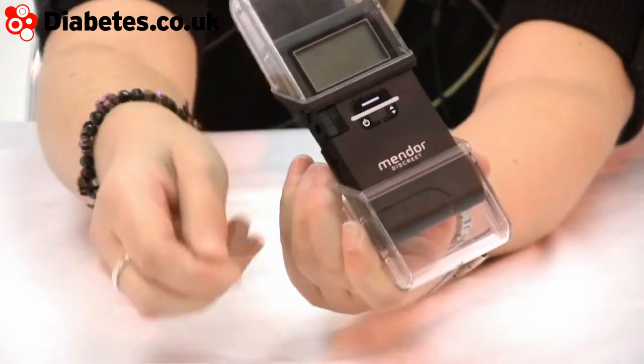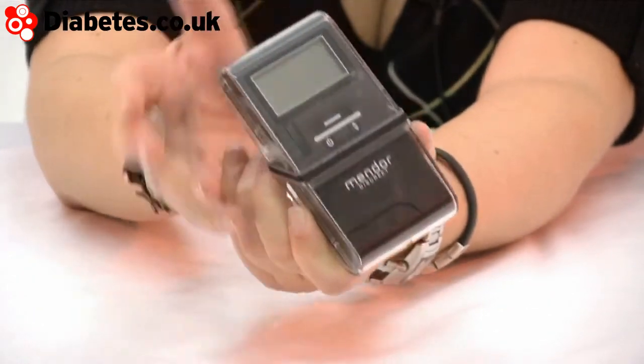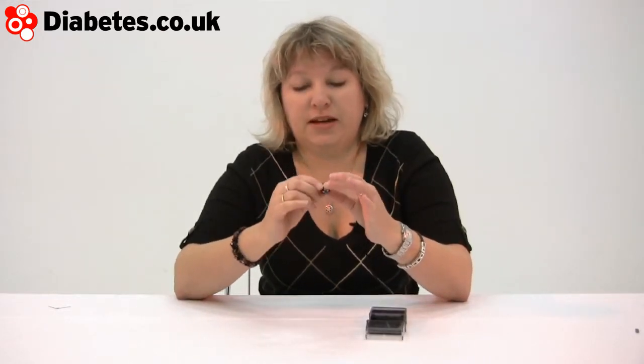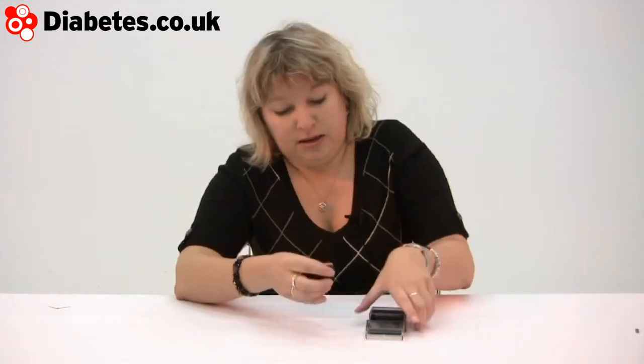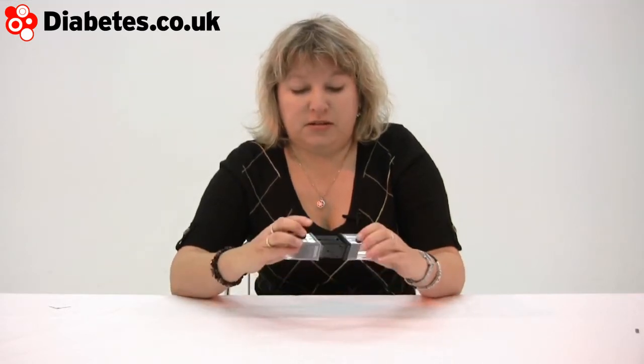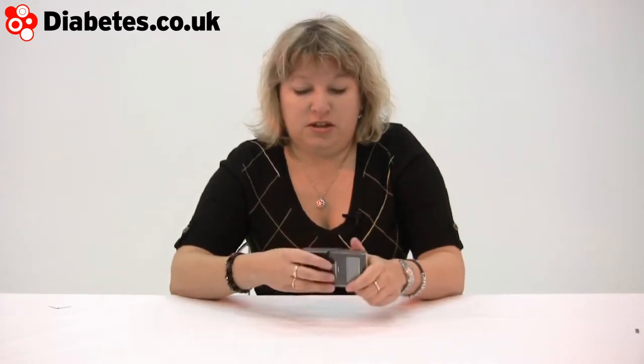And then you can just pull that out and close it all down again. This is the bit where the lancing device is, and to be honest, we'd need a really close-up camera to show you this — it's tiny. It's not going to lance you unless you want it to. That's perfectly safe, there's no accidental stuff going on there, and you shut up shop like that.